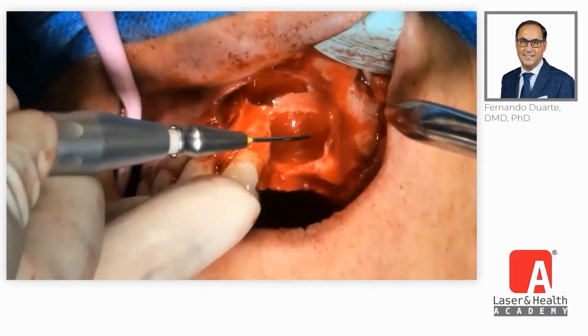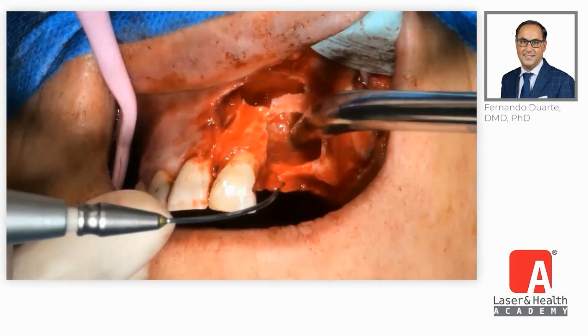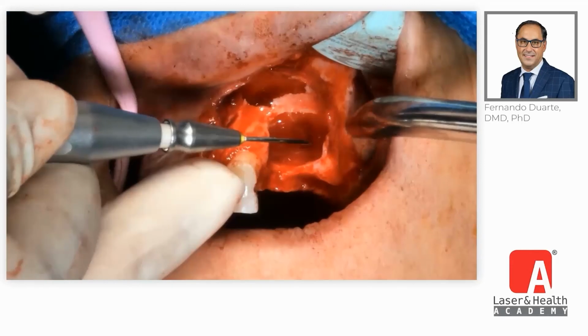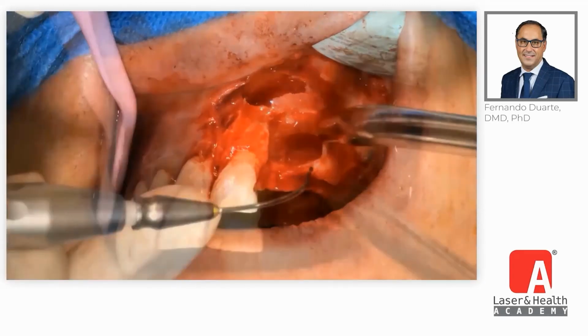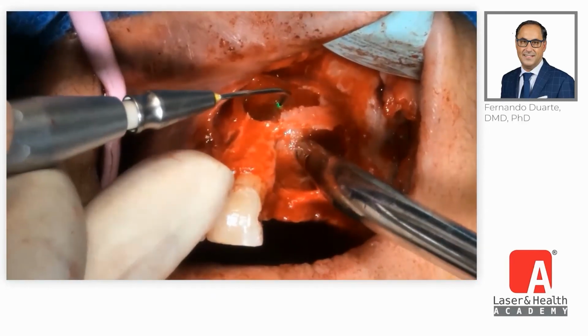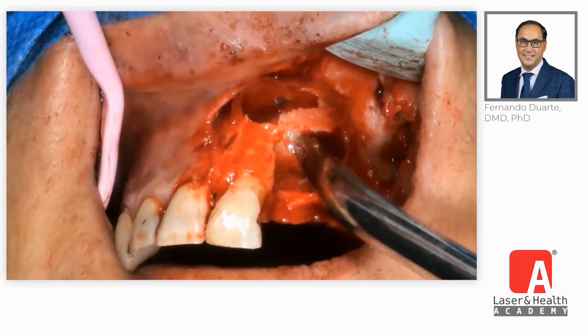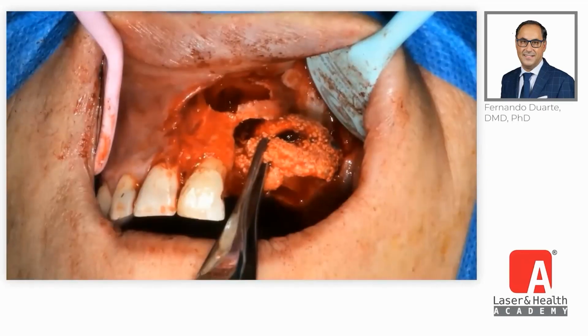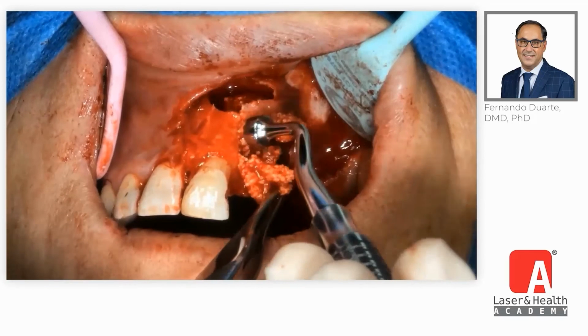Now, as you can see here, we are applying the protocol for the cyst cavity preparation, including the granulation, disinfection, and deepithelialization, and also clot stabilization, as you can see here, with the neodymium YAG, the final part of this protocol. Now, it's important also the bone reconstruction. We use the same surgical time.